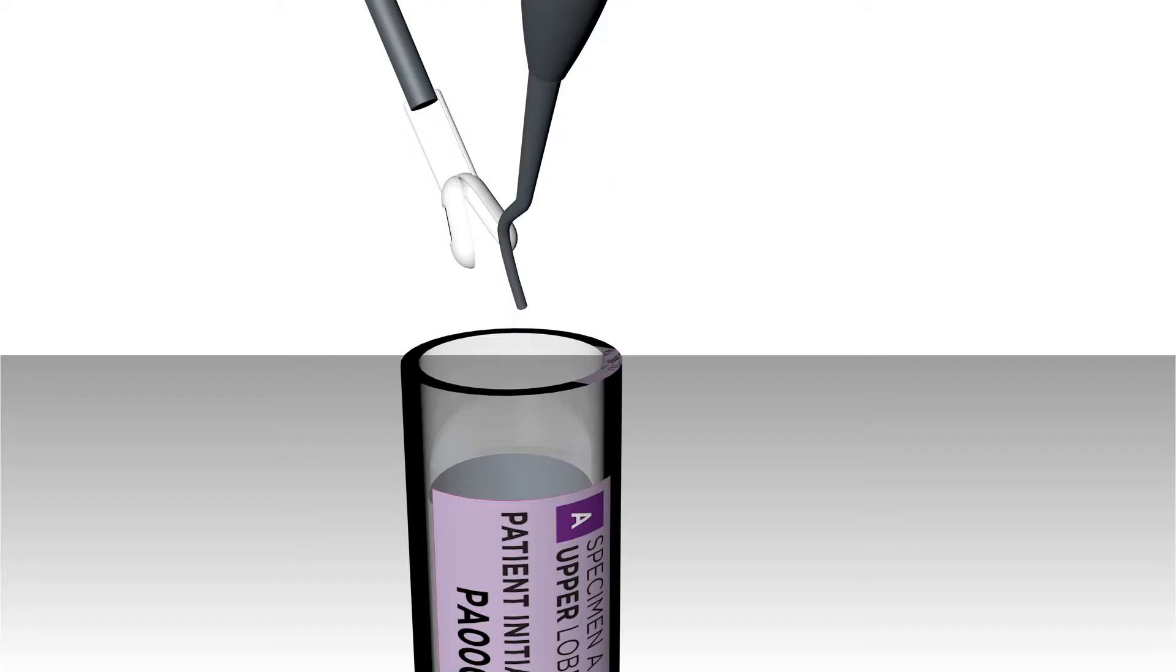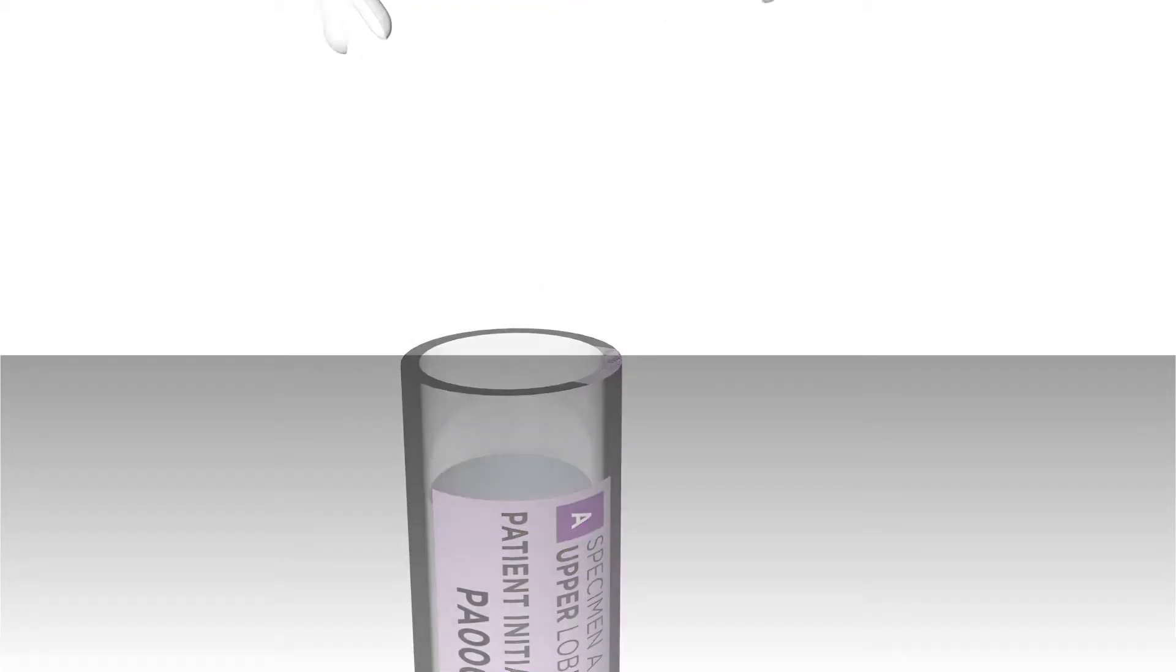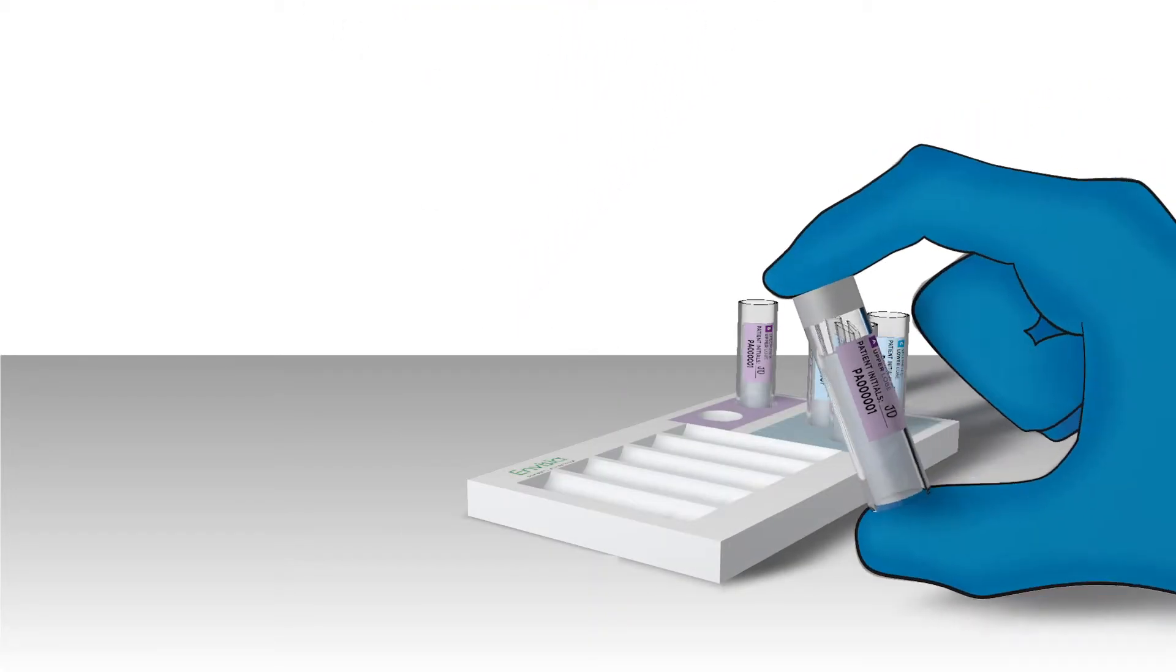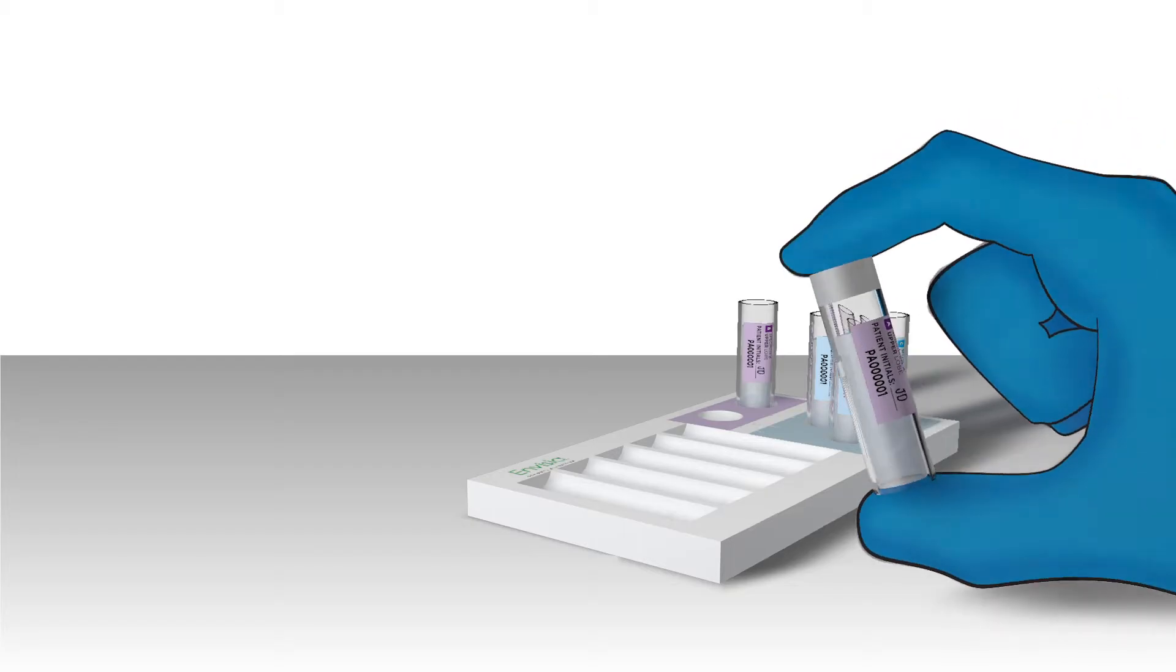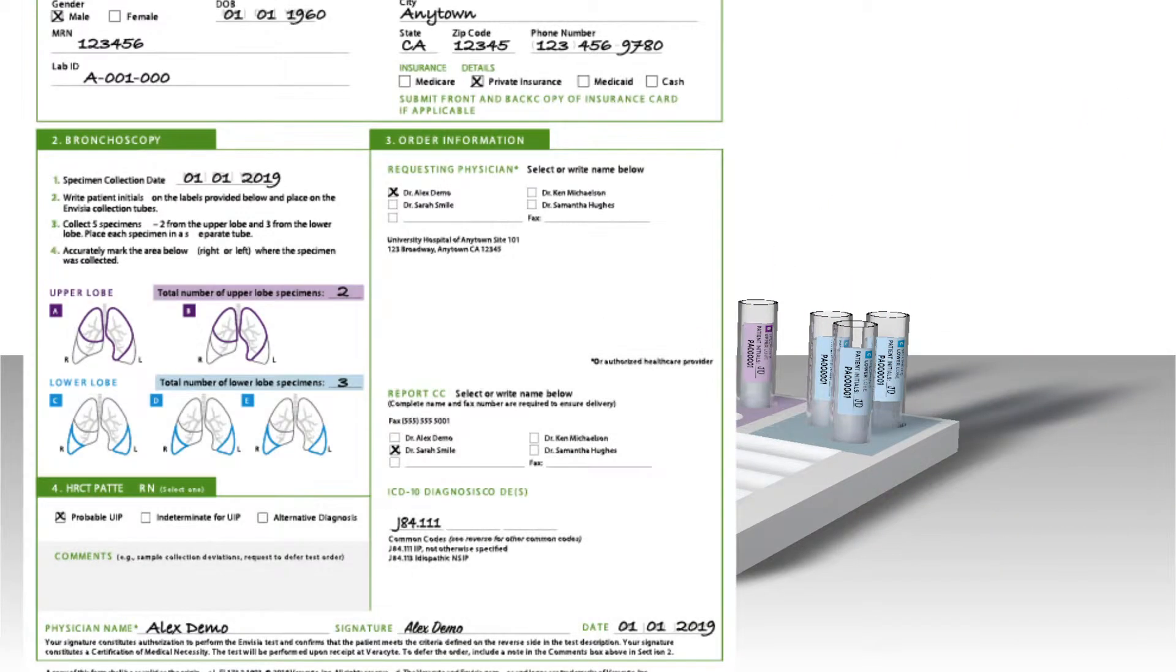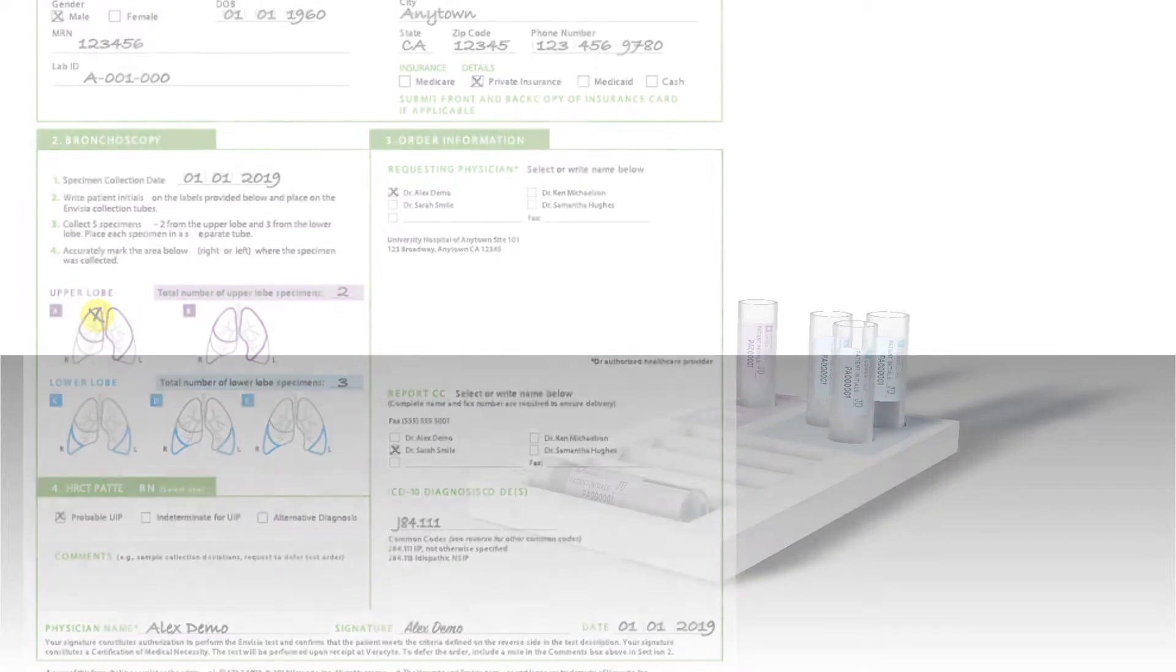Do not allow the forceps to touch the solution in the tube. Gently mix the solution, lay the tube flat in the stand, mark on the test requisition form where the specimen was collected from, and then dispose of the transfer tool.